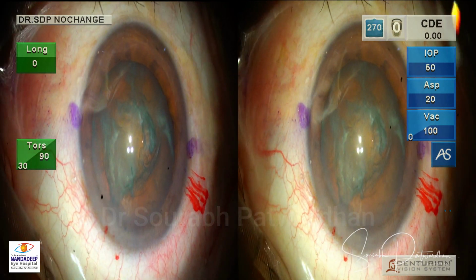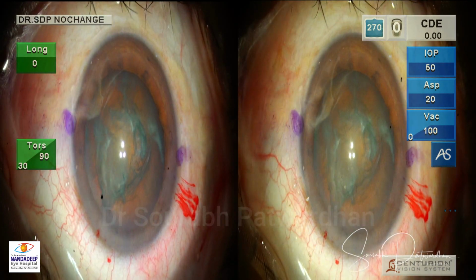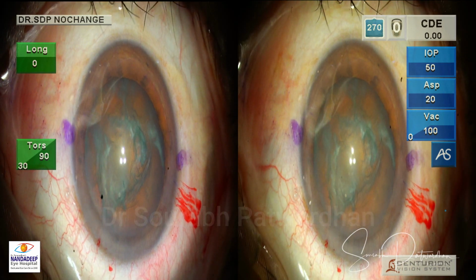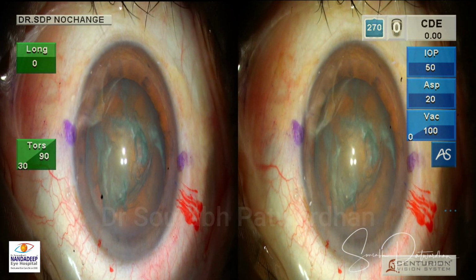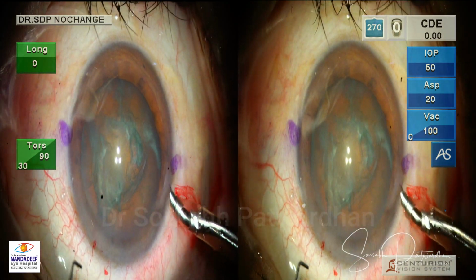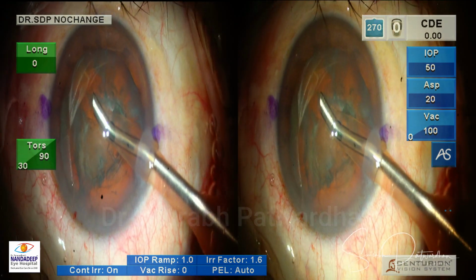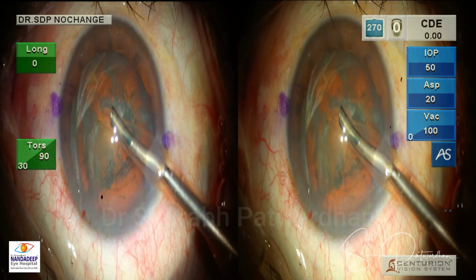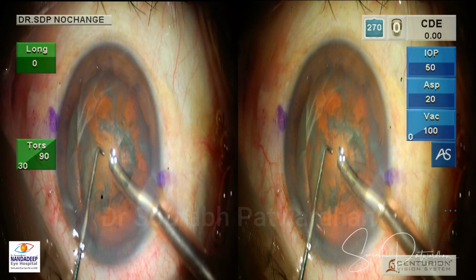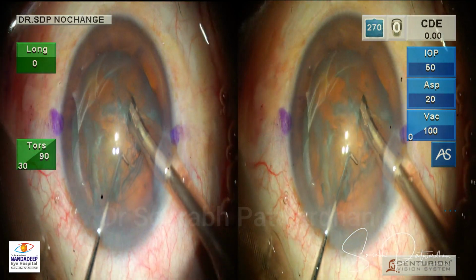When you are using a rexis marker, is there any risk of causing epithelial damage, sir? Yeah, it can if you rub it on the epithelium, but if you press down, then it will not cause that. And this mark is very temporary. Okay, so yeah, you can talk about the incision. I think we have used 2.4.